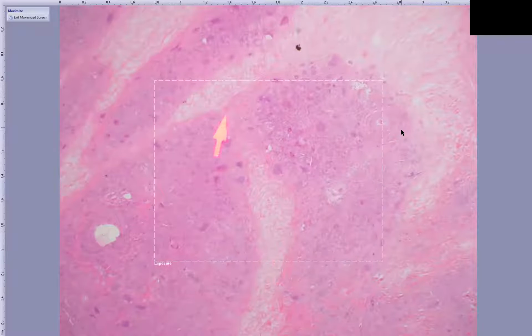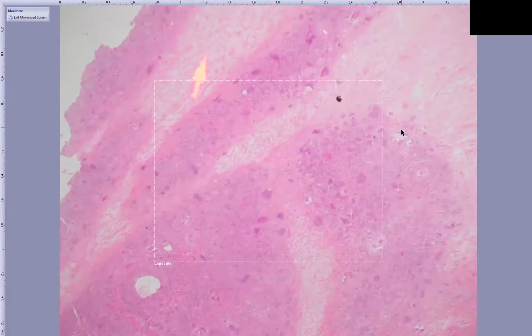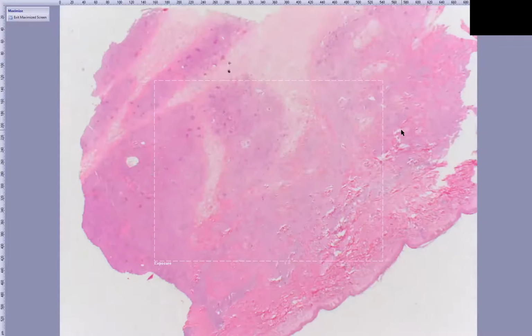So we talk about X-shaped necrobiosis as being fairly characteristic for necrobiotic xanthogranuloma, such that when you look at this on low power, you would appreciate that X-shaped intersecting quality of these bands of necrobiosis. Okay, kind of that X-shaped intersecting bands of necrobiotic or degenerative collagen.